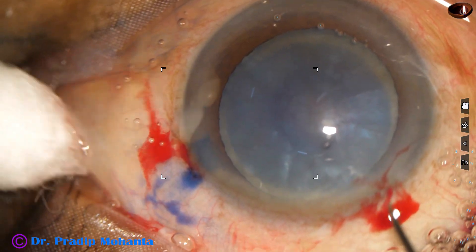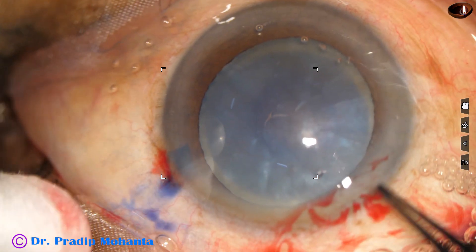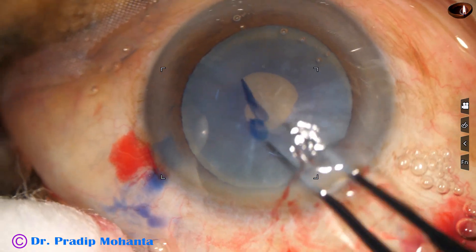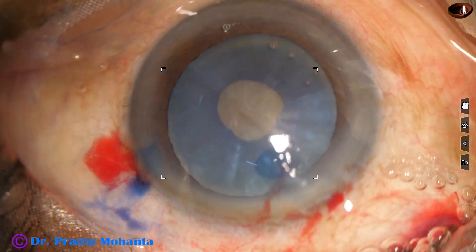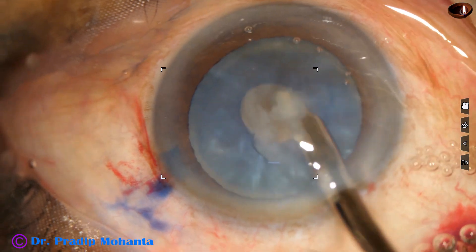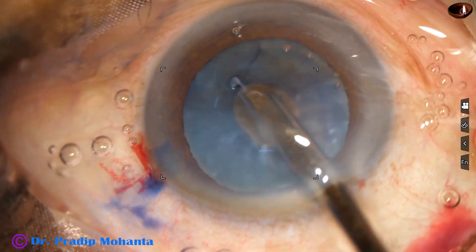Capsulorhexis — I am using a needle to incise the capsule. I get a tag. I hold this capsular tag and do a small rhexis at this moment. There is some loose cortical matter and there is some convexity of the anterior surface of the lens, so I wanted to decrease the intralenticular pressure for a safe rhexis.